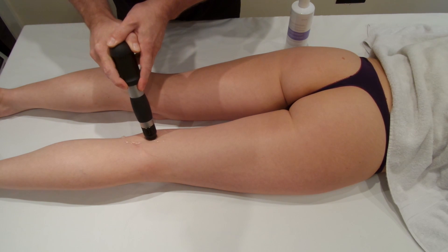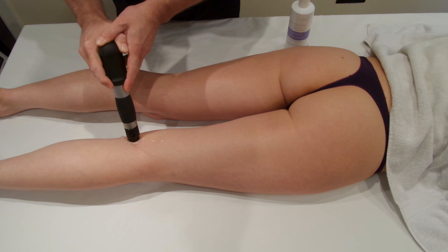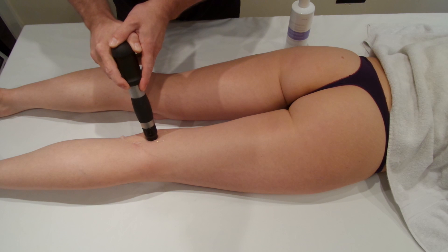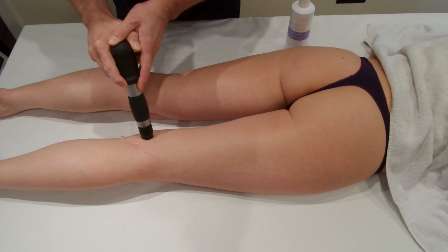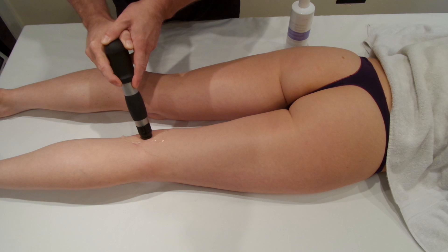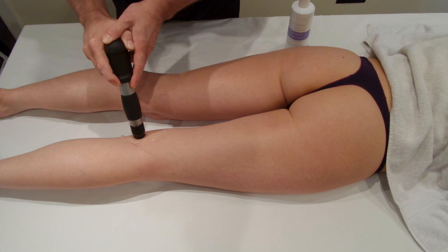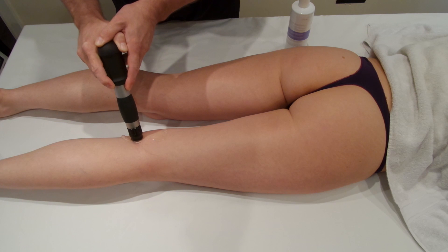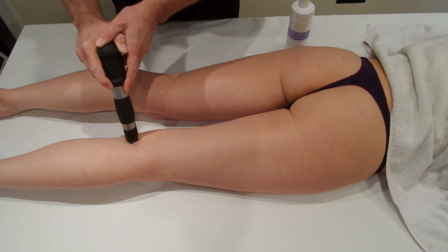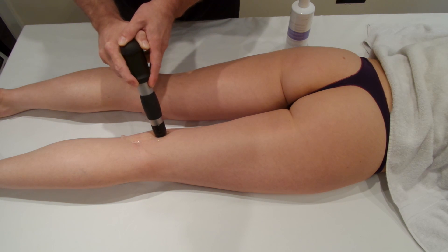You often roll off the hamstring tendons as you're doing this with a 15 millimeter head. Sometimes as you're going across the hamstring tendons you'll actually be able to feel lumps of scar tissue — smooth, lump, smooth, lump. If you run into a lump, just hit it from a slightly different angle rather than trying to come straight down through the top of it. You might just have to go from the side slightly either way, and often the patient will give you feedback about where the most painful area is.